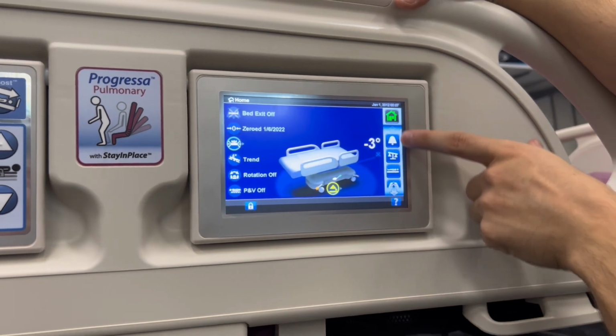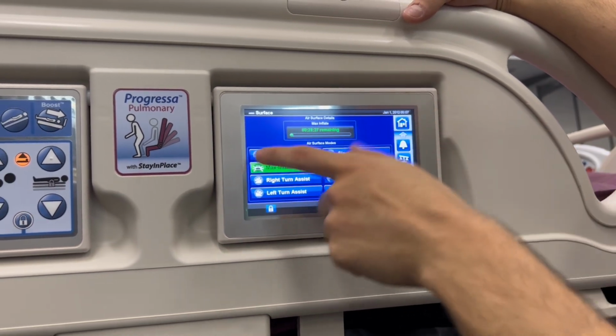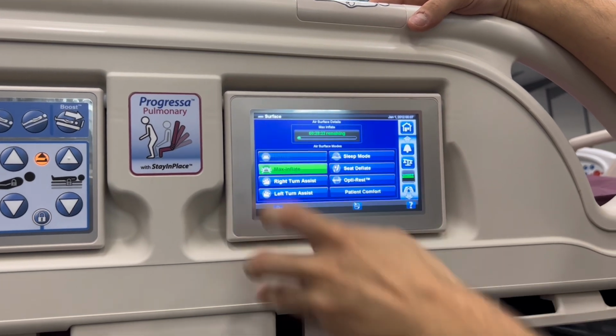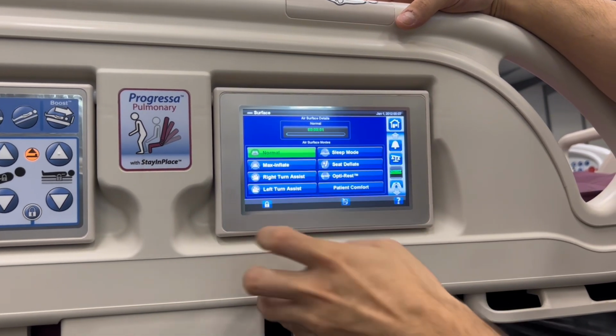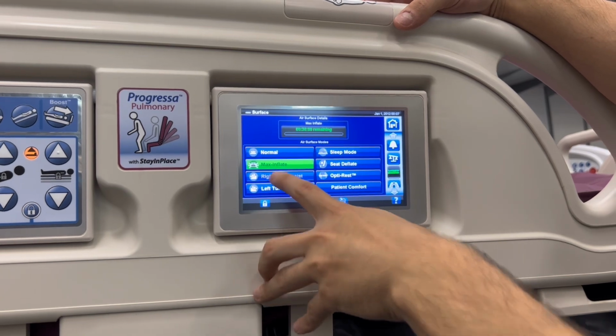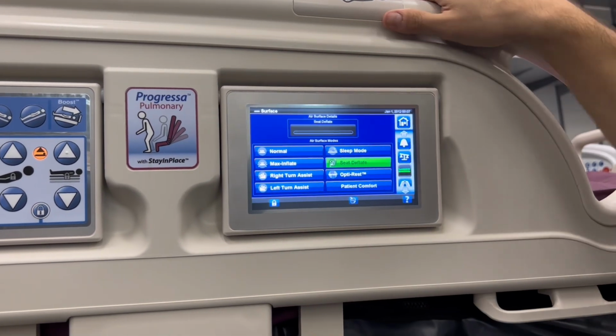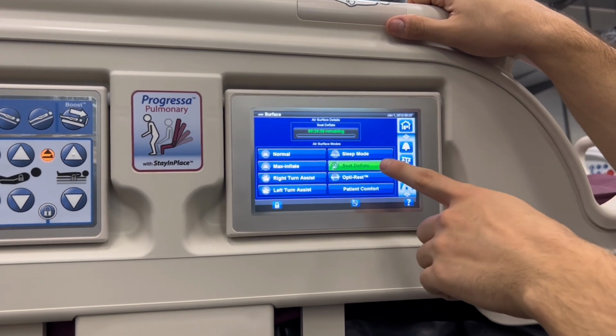Any of the functions that we want to change are all going to be done from over here. So here we have a lot of different functions that we can do. So we could keep the mattress in a normal state, inflate the mattress to be firm, turn right, turn left, deflate the seat if we're going to do that seated function, which we'll dive into in a little bit.